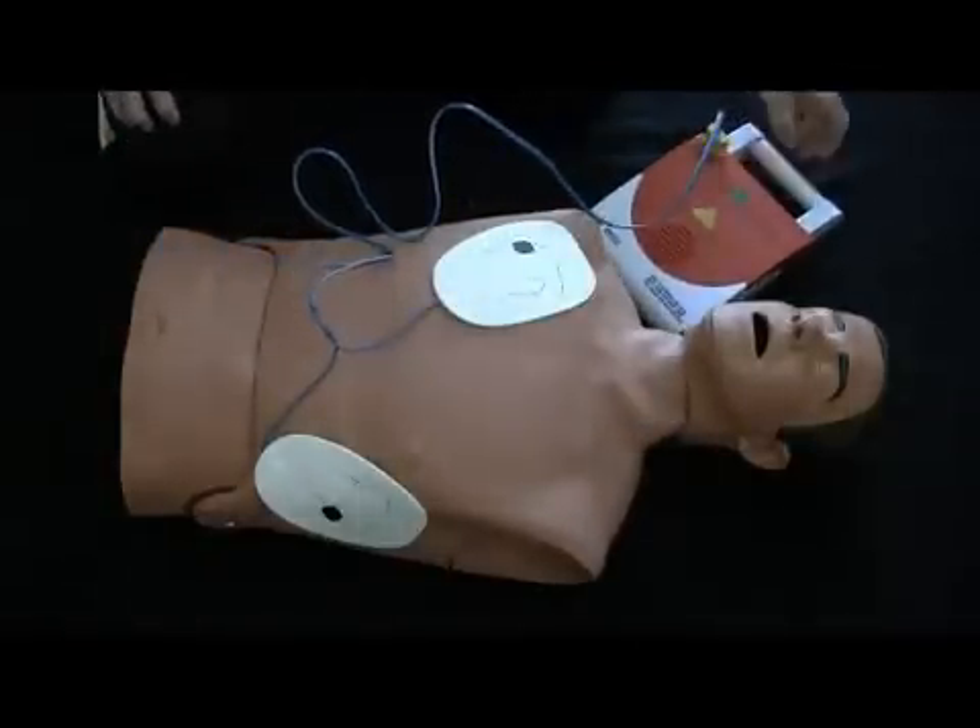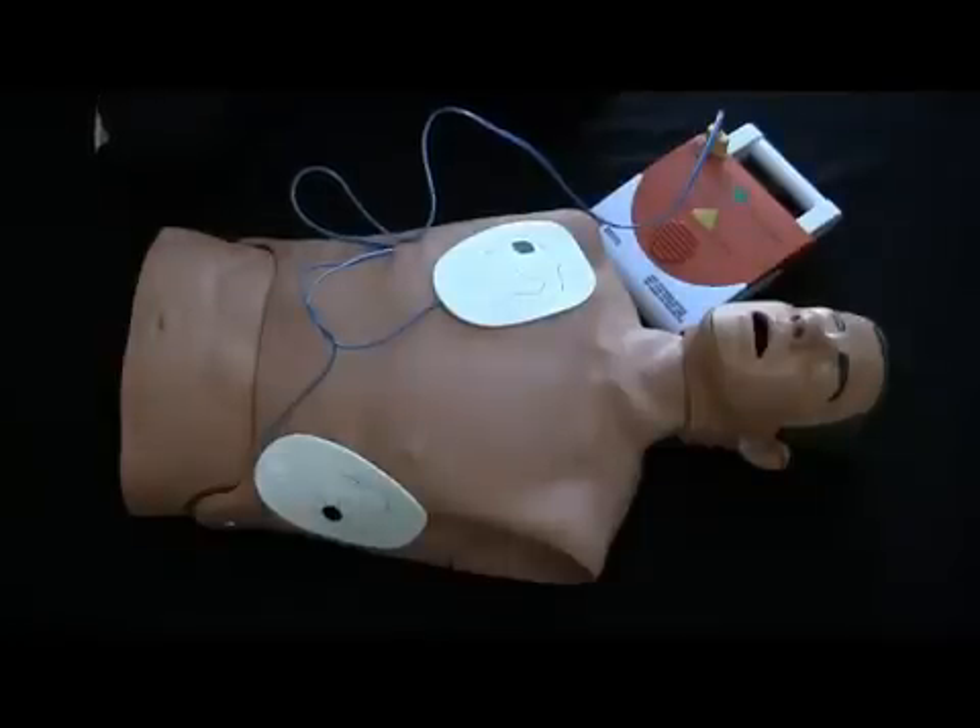Analyzing rhythm. Everyone stand clear. Shock advised. Charging. Everyone stand clear.